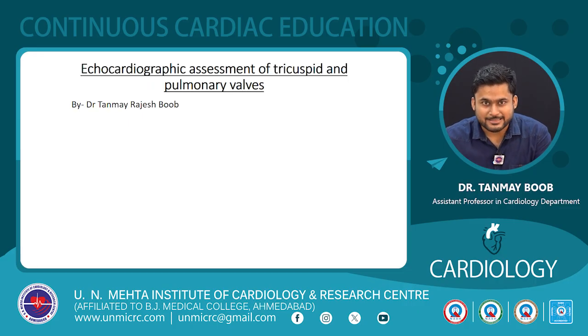The topic for today's presentation is Echocardiographic Assessment of Tricuspid and Pulmonic Valve.